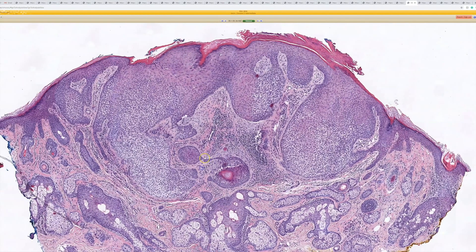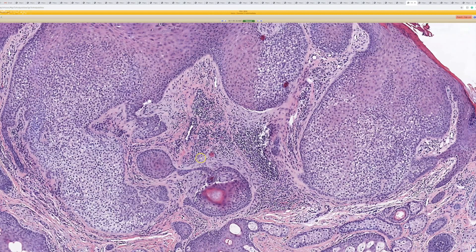In the middle, they can get kind of busy and stringy and have little cords and strands that look infiltrative. When you have a lot of that, you can call it a desmoplastic tricholomoma, which is a totally benign lesion.